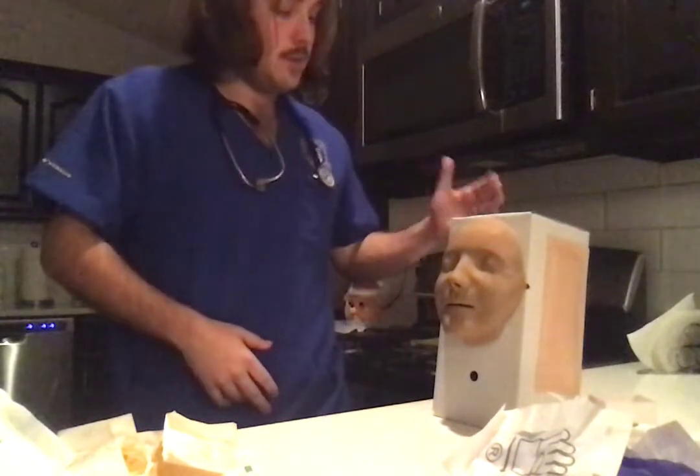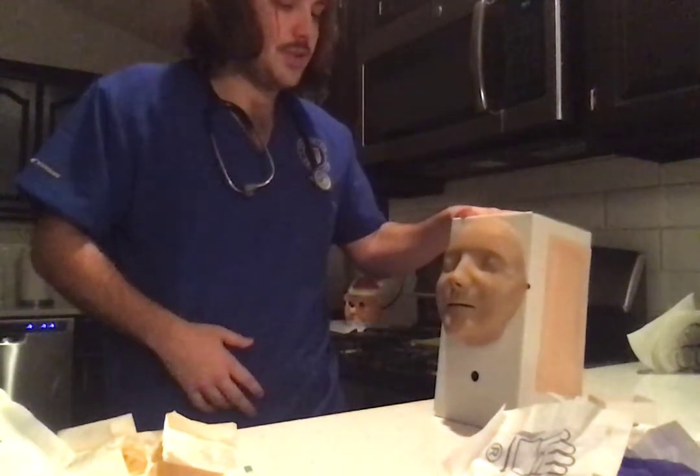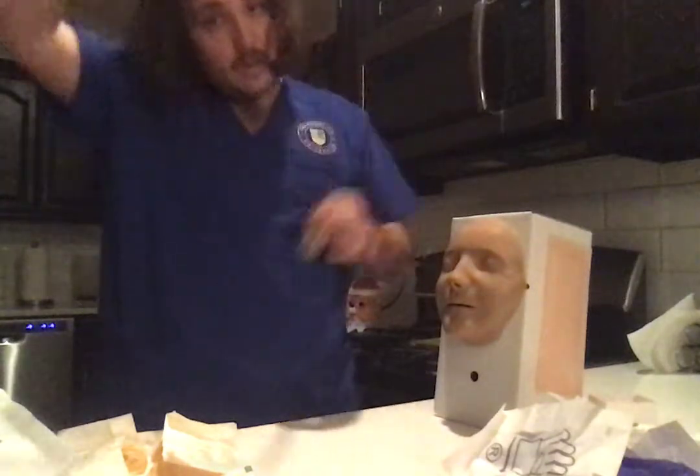As we continue, you're going to provide privacy to the patient by closing a door or a curtain, and then you would explain the rationale of why this is happening, answer any questions, and get verbal consent. Once we've gotten verbal consent, we're able to raise the patient to hip level in their bed. We place the patient in a semi-Fowler or Fowler's position, and then we would auscultate the lungs.